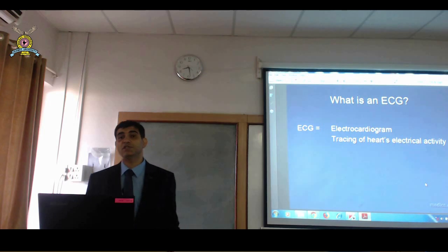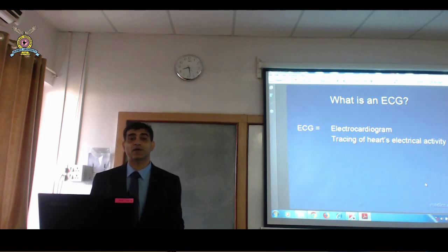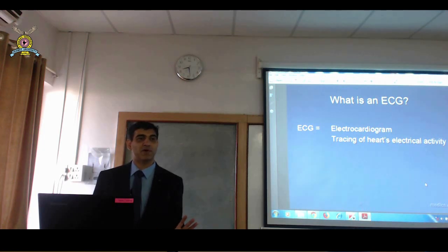So basically, what is an ECG? An ECG is a tracing of the electrical activity of the heart. It's a very simple measure which will give an idea about what's going on in the heart. Saying that, I would say a normal ECG does not mean that the heart is normal. So that's an important thing you should all remember.